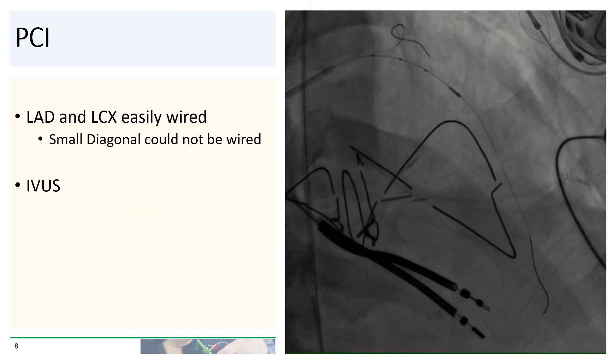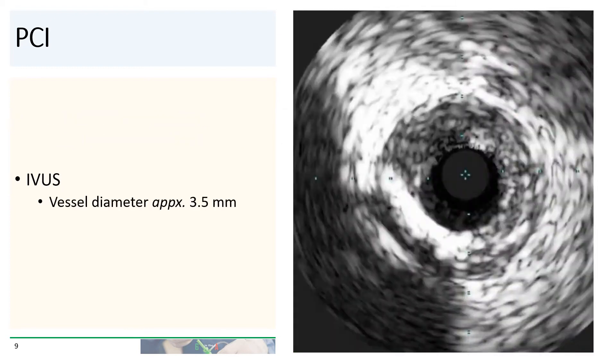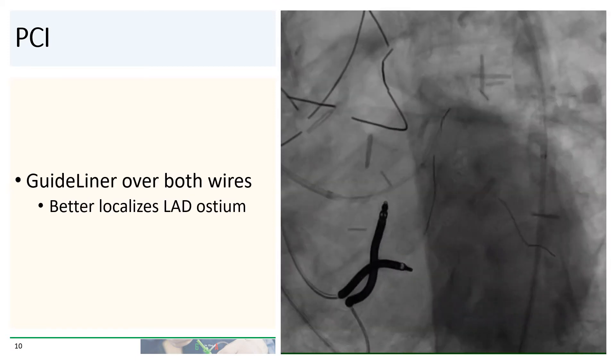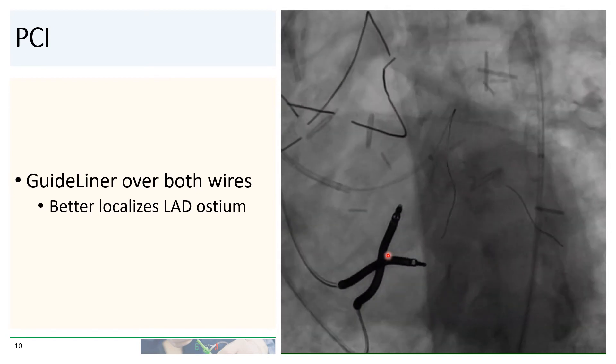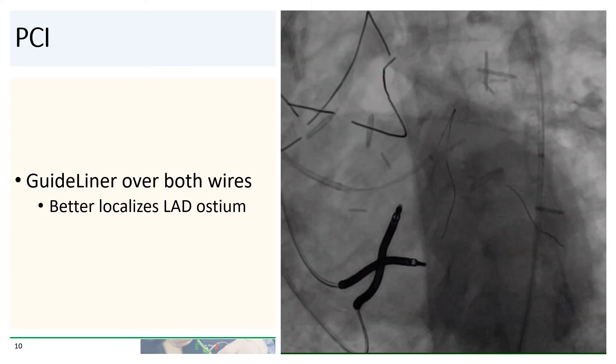We ended up wiring the LAD and the circumflex. The small diagonal branch distally could not be easily wired. We then performed IVUS to assess vessel size and lesion length, and IVUS showed that the vessel size diameter was approximately three and a half millimeters. Because the lesion was fairly proximal in the LAD, we also used a guide extender, advanced over both wires, to give us an additional landmark to localize the ostium of the LAD.